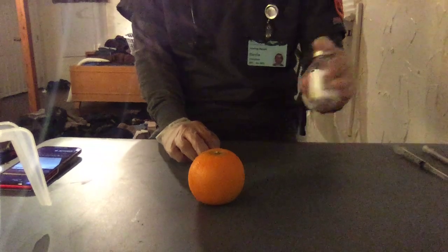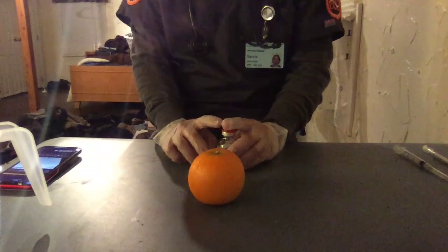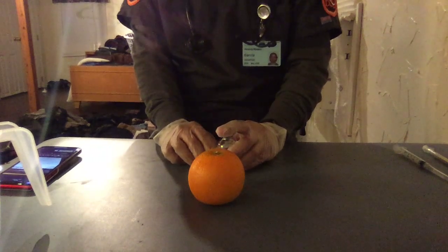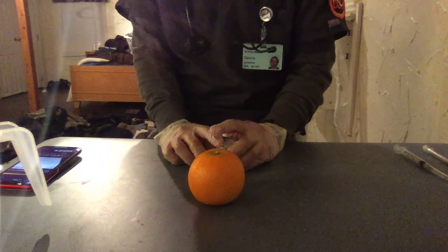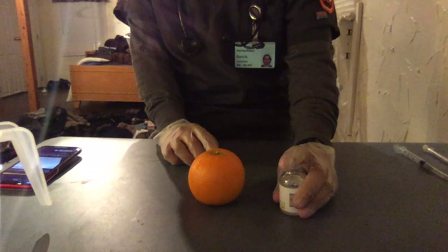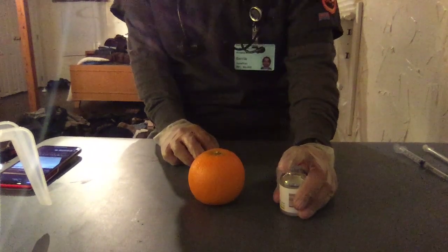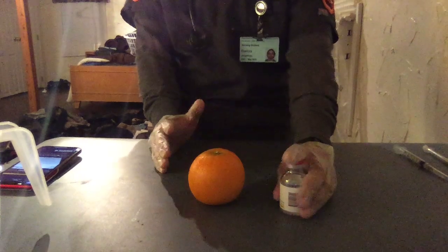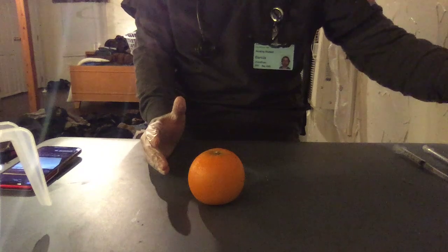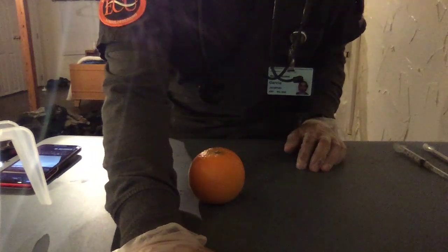Then I get my second one, 0.5 milliliters of saline subq to be administered one time now. And then my third medication will be 0.3 milliliters of saline to be administered intradermally, stat. So that is my third check for my medication. So then I do make sure that we have everything that we need before we get in there.